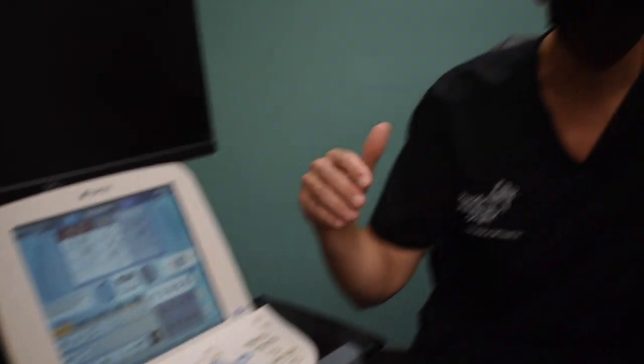Hey everybody, welcome to the TOPCON instrument. We're going to have Phoebe walk us through how to perform a distance refraction sequence on the TOPCON. She's going to mainly focus not so much on the procedure itself, but on how to navigate through the instrument panel so that when you're performing your distance refraction, you can be more efficient. She's already done my retinoscopy, and she's going to begin the whole sequence after retinoscopy, starting with the 2040 blur and moving forward.